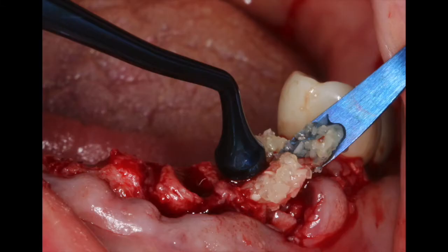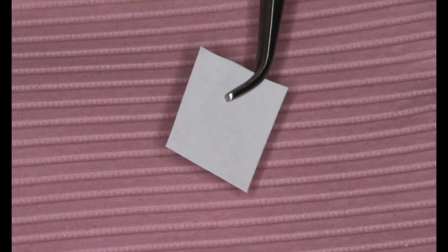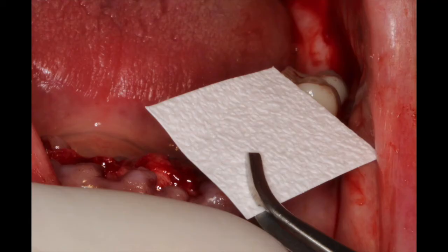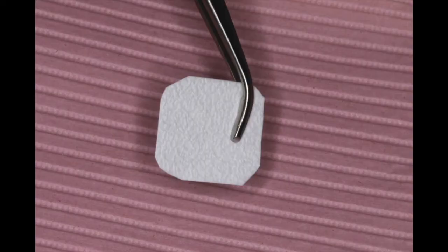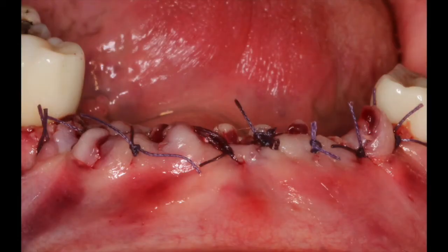Remember, this graft is osteoconductive, serving as a scaffold. It's also osteoinductive in that it stimulates progenitor cells to differentiate into osteoblasts. We must protect our graft site from invagination of epithelium, so here we're going to use an epi-guide from Golden Dent, which is a long-lasting resorbable membrane. It will be placed beyond the defect at least two millimeters and passively placed onto the lingual surface. This protects the graft site from invagination of epithelium, and here we used vicryl sutures to control the site. This graft heals very quickly and very well because it is also osteogenic — we have bone morphogenic proteins, which are the cell mediators in this whole regeneration process, and it rapidly differentiates into bone.